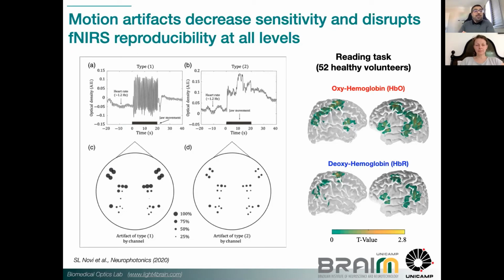So you can't actually isolate the motion due to the task from the task itself, right? Every time you repeat the same task, in this case reading, you will repeat the same motion. And if you do that, you can see that there are, specific to this task, two types of motion. One is related to the motion of the jaw, as you are moving and speaking, and that can induce some disruption in the signal. We are exaggerating here; this was an exaggeration by just the jaw movement.